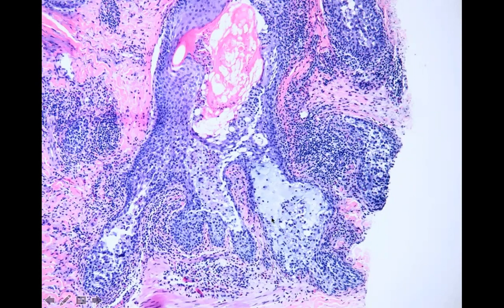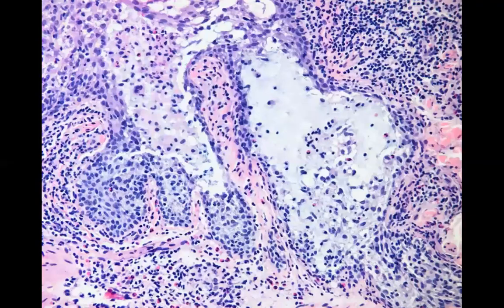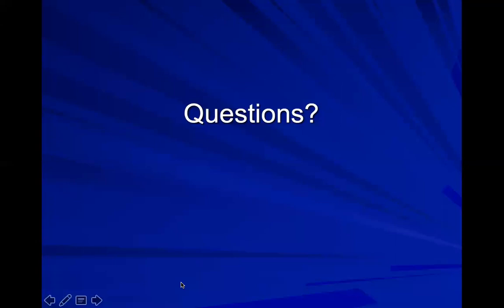And so it's fairly subjective whether you think that this could be MF, even if you do all the stains. If it's one little area and it's a kid, I probably would just follow it. But if they have a fairly extensive involvement, it's probably a good idea to do gene rearrangement studies to make sure you're not missing mycosis fungoides. Here's an up close. This one has a lot of eosinophils. Also, a big bug bite in the area causing a lot of edema. You can also get mucin in the follicle, but this one's pretty cleanly in the follicle. So this is follicular mucinosis. Okay, and that is it for alopecia and follicular disorders.